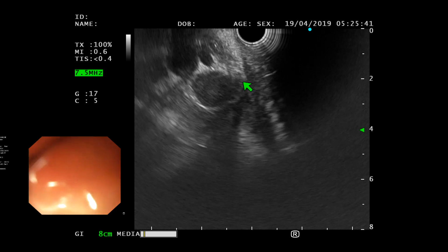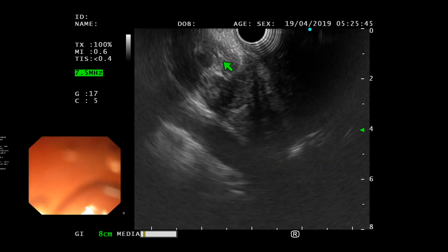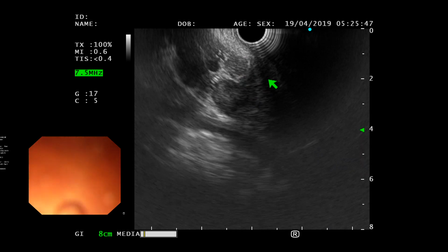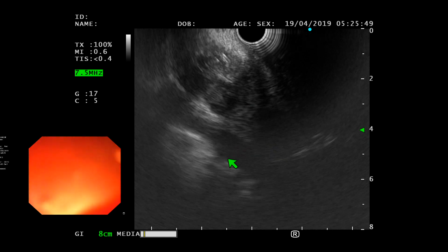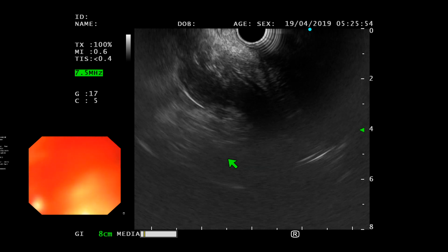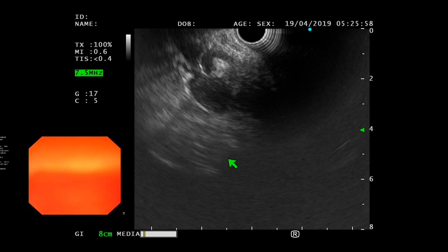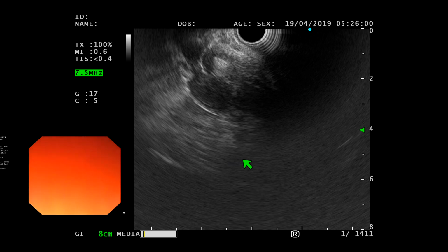So when you have these two parallel lines. So the bile duct, if you look at it, is completely collapsed as it goes to the intrapancreatic course, and then there is this mass around. Okay, yeah, but maybe because of the stent it's less in the CBD. Can you just freeze it for a second and just highlight the stent? Just show them how it appears on EUS, if you don't mind.